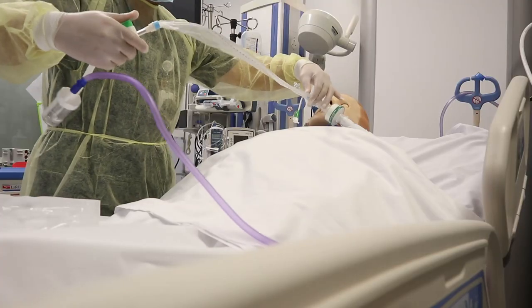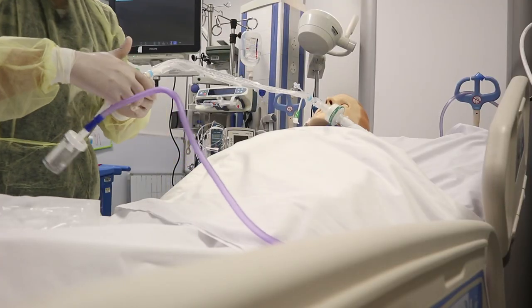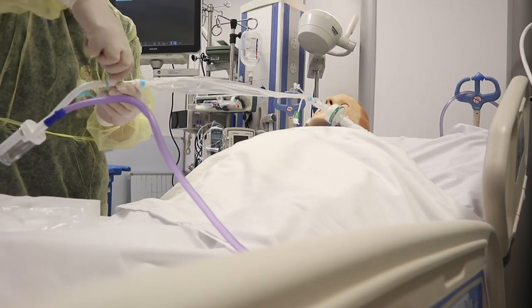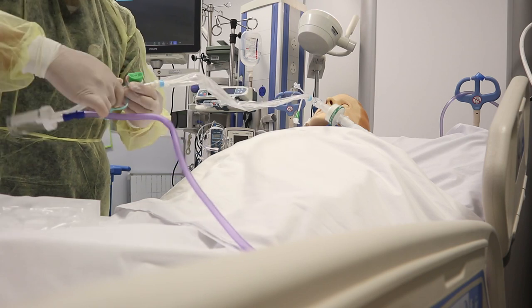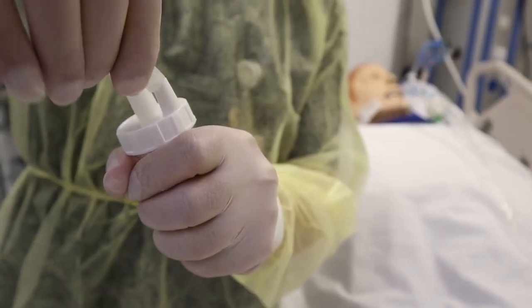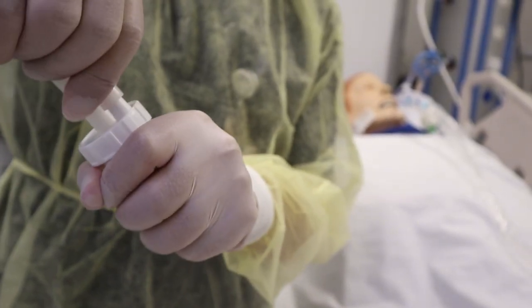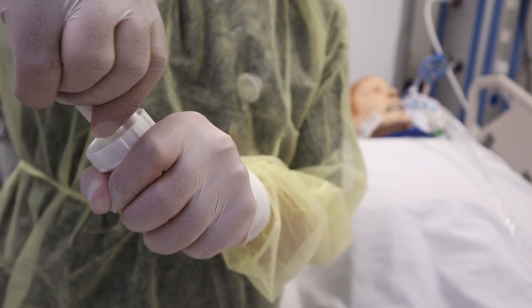Then switch off again. Disconnect your specimen bottle. Close your specimen bottle. Keep it in a biohazard bag.